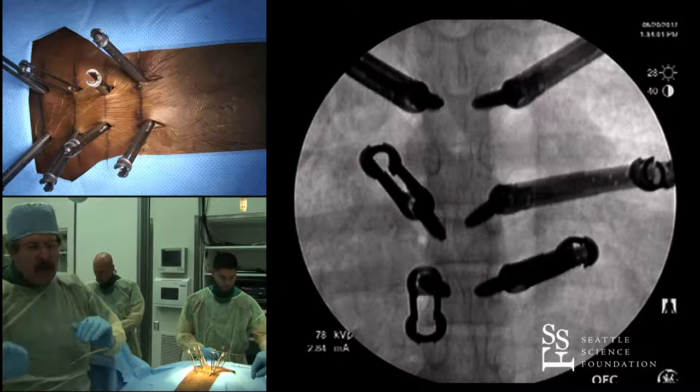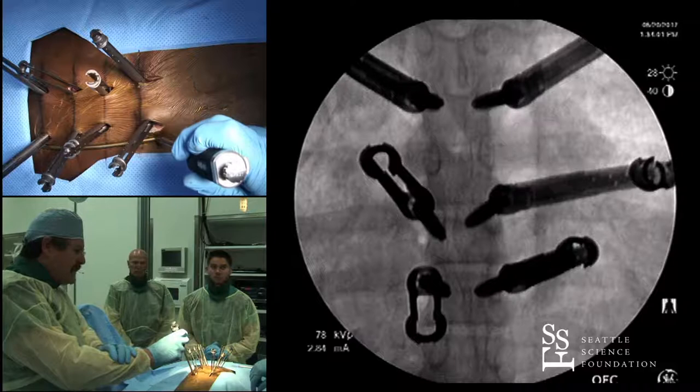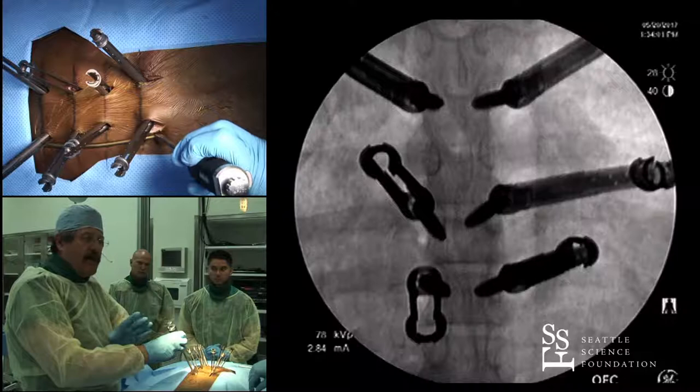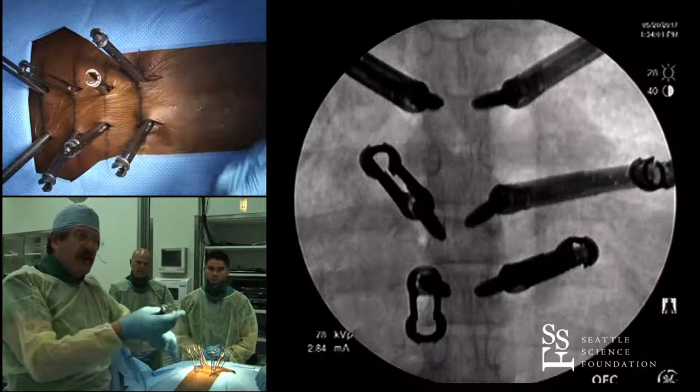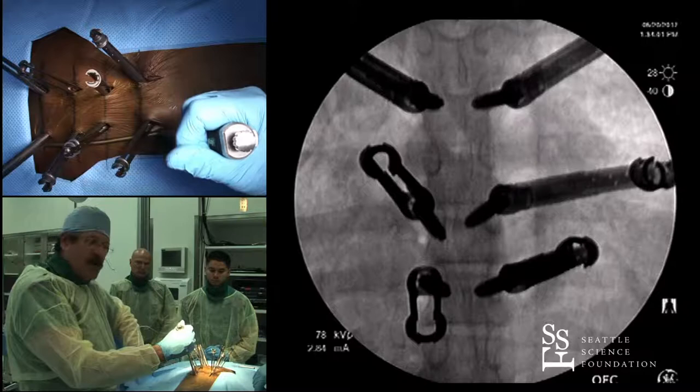If it's not matching I'll pull my rod back out and re-bend it. Selecting rod length is also difficult. In the thoracic spine I can lay my rod against my screws and get a sense of length — because they come out in a divergent fashion, the rod will probably be a little long by the time it gets to the spine, but that's okay in an ankylosed spine because it doesn't move. In the lumbar spine, screws come out convergent, so if I match them at skin level the rod will be too short.